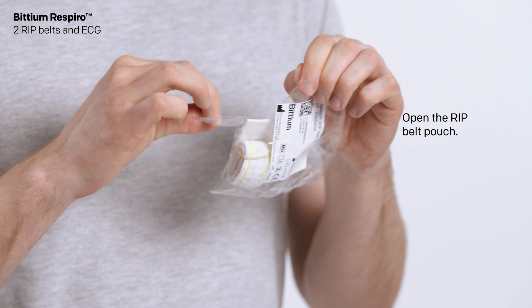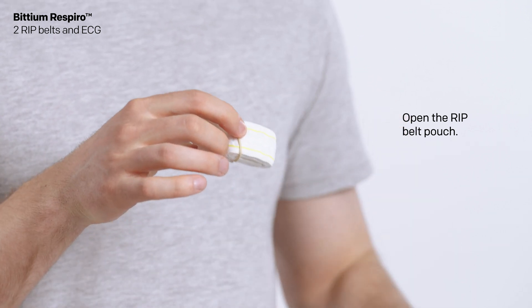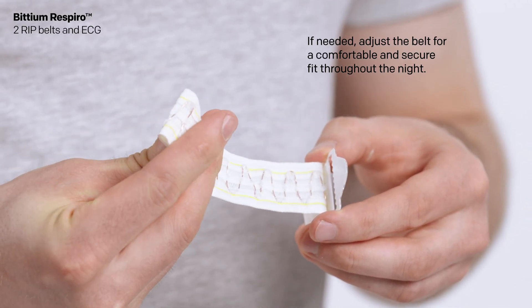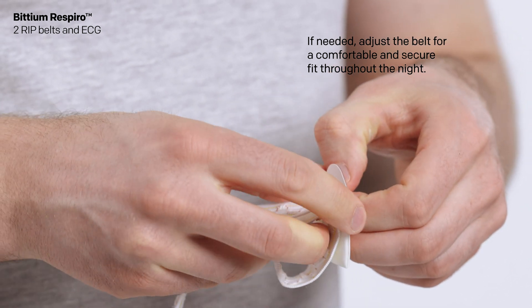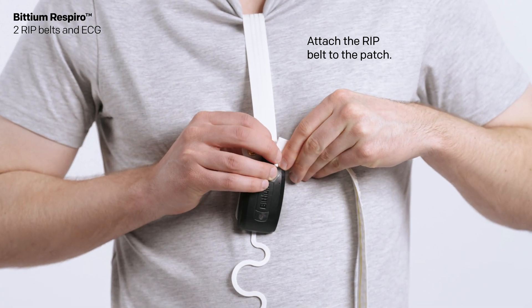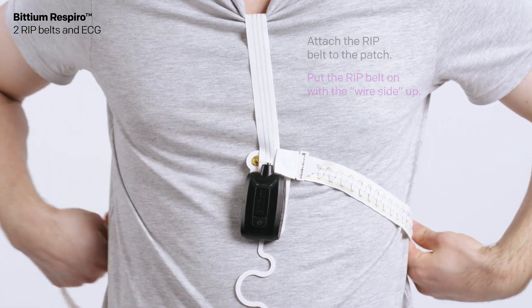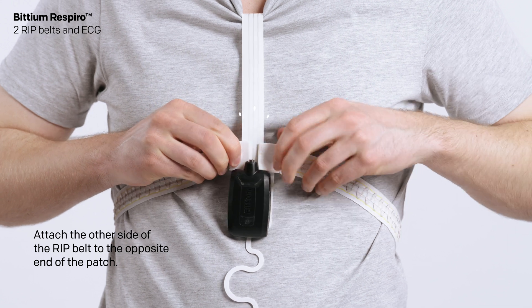Open the RIP belt pouch. If needed, adjust the belt for a comfortable and secure fit throughout the night. Attach the RIP belt to the patch, putting the RIP belt on with the wire side up. Attach the other side of the RIP belt to the opposite end of the patch.